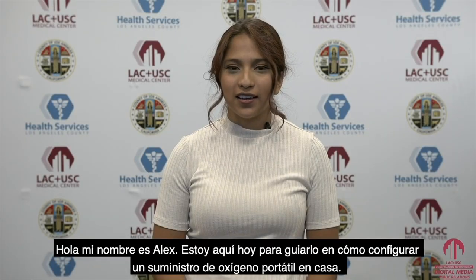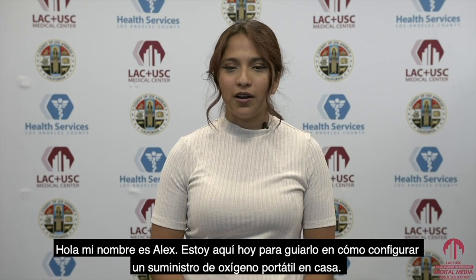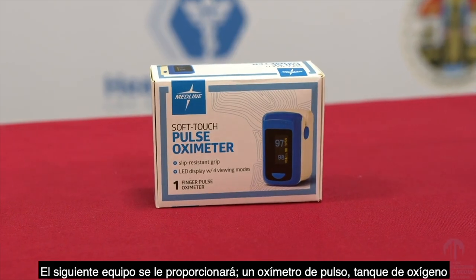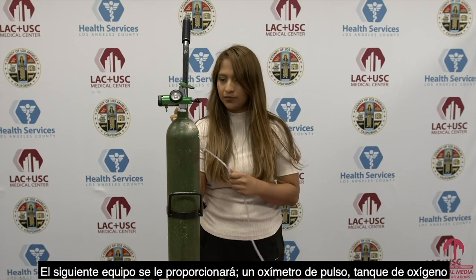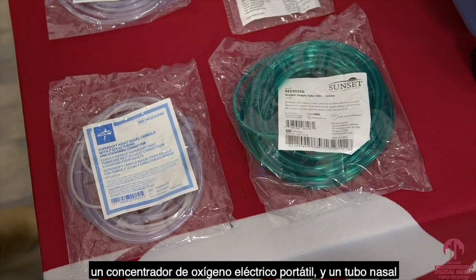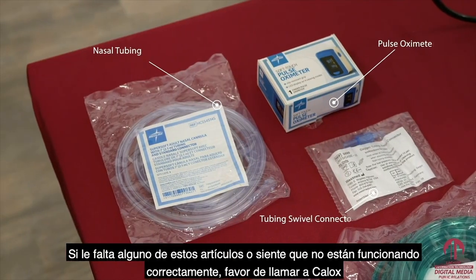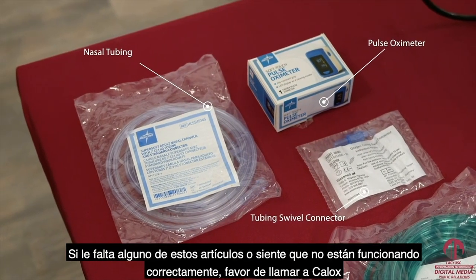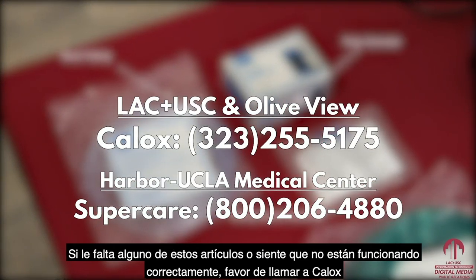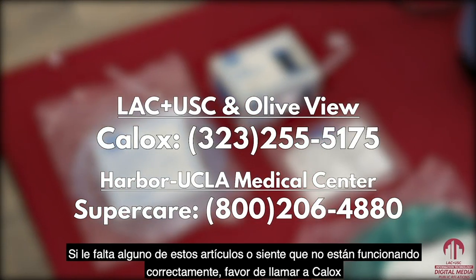Hello, my name is Alex. I'm here today to walk you through how to set up an oxygen supply at home. The following equipment will be provided to you: a pulse oximeter, a portable oxygen tank, an electric oxygen concentrator, and nasal tubing. If you're missing any of these items or feel that they are not working properly, please call KLOX at 323-255-5175.